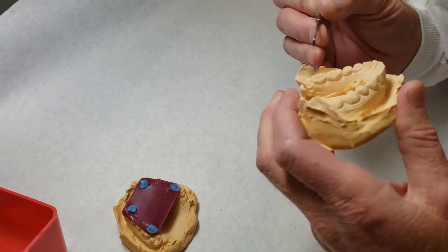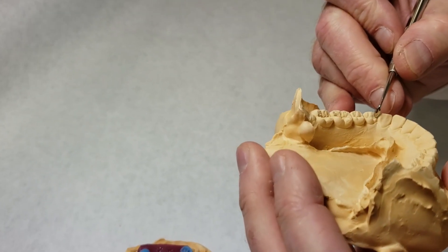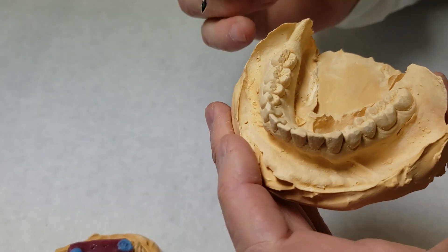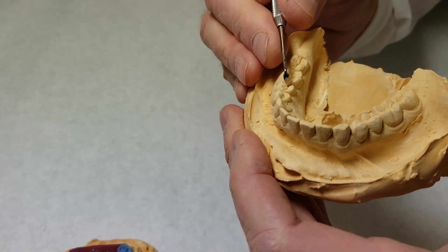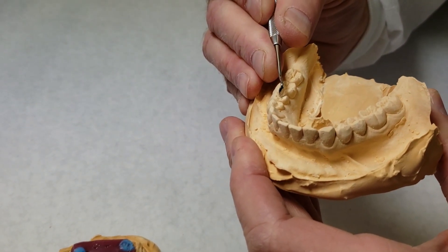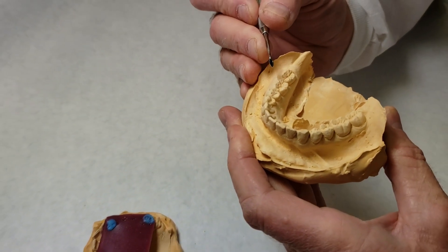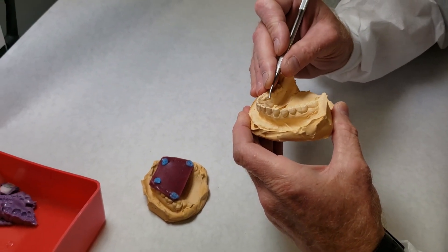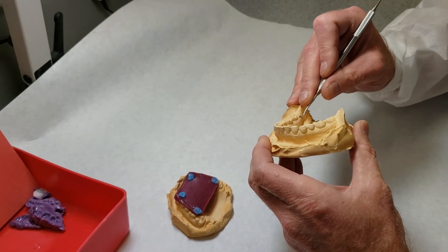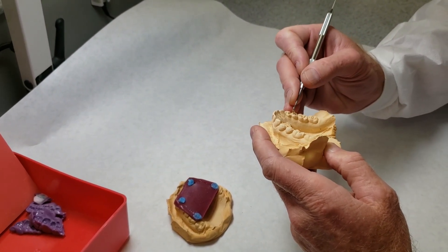We've gone around the buccal — hopefully we don't have too many. There's a small one right there on the lingual, and there's another one right here. It's a good idea to move your cast around and look at it from multiple directions. If you're going to err when you cut the ones out on the occlusal, you want to take a little bit more than what would be there so that you don't have a high spot when you introduce your bite record later on.